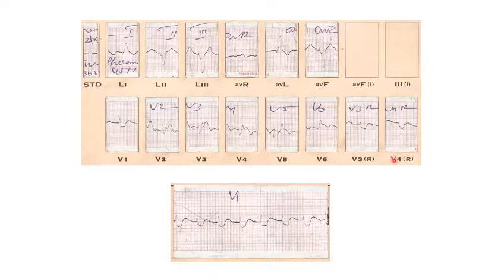Three things. It's not typical LBBB, because V5 and V6 have Q waves. The presence of Q in V5 and V6 tells you that the patient has developed myocardial infarction. Sir, is slurring in aVL part of the LBBB itself, or should we consider it significant of MI in this case? Yes, you can consider that. That mainly indicates evolving myocardial infarction. Fragmentation can be discussed.